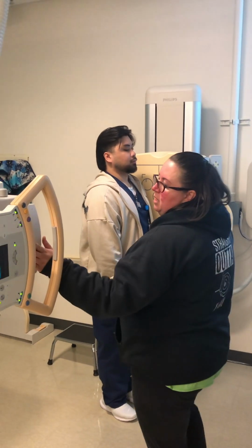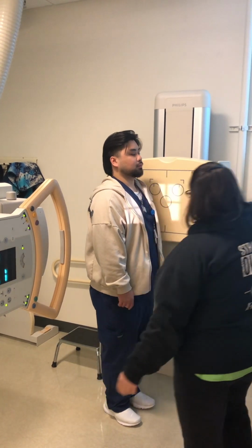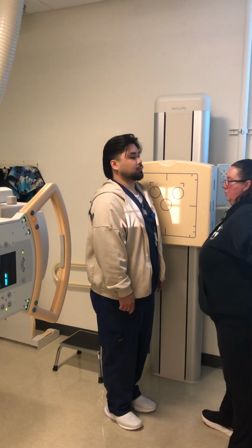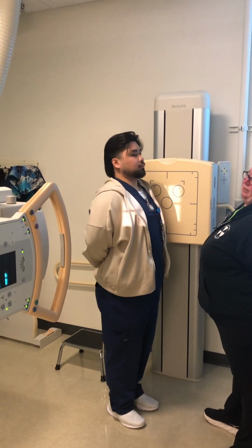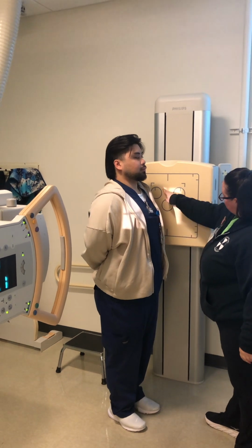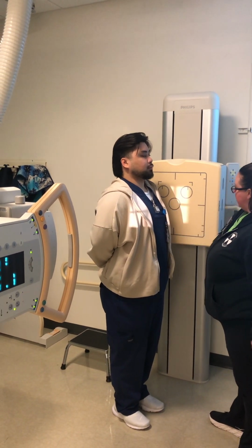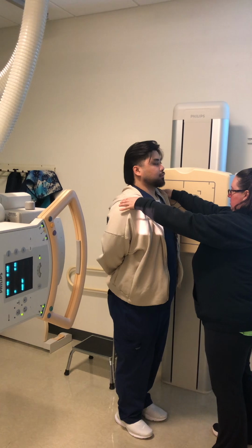All right. So, patient put their arms behind their back, so they really puff out their chest a little bit. Now, note that right now, I have it so that the shadow skims that center line. That's okay, but I do want to make sure it's not rotated.